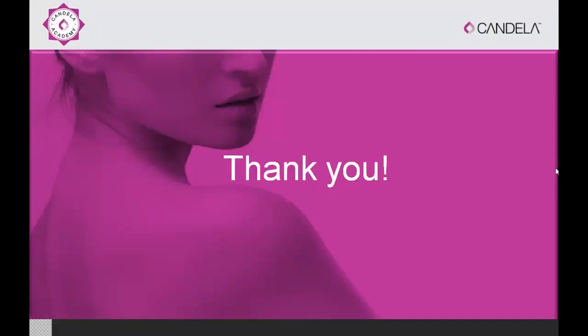I don't think it's particularly a problem if you start with the zoom first, unless you're treating epidermal pigmentation. If you use the zoom first for epidermal pigmentation, you get some darkening, which may impact the resolve, but in general I don't think that would matter much. It's just the way I would do it.